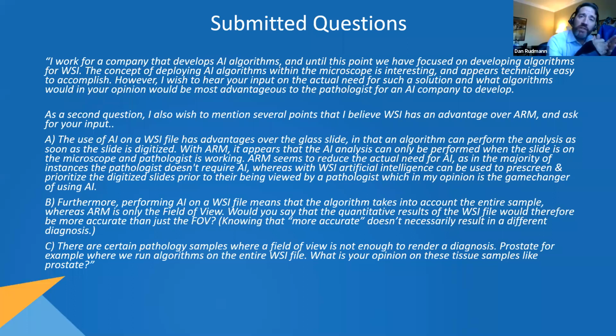So, and to be honest with you, I think one of the things that we deal with in non-clinical toxicology, it maybe our clinical colleagues in human medicine don't have to deal with as much, is that a lot of what we look at is normal. Because we are looking at a large tissue section, right? We're not looking at a biopsy coming out of a mass or something like that. So I think for us, maybe as whole slide imaging gets more incorporated, there may be some more advantages for a whole slide imaging AI approach for us for screening than maybe it would be in the clinical world. So that may be where there's a little bit of a difference in the non-clinical and the clinical space.